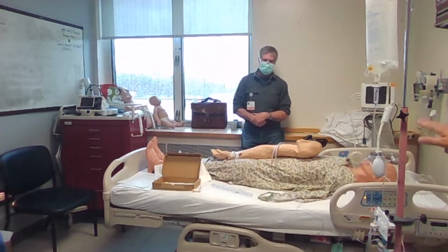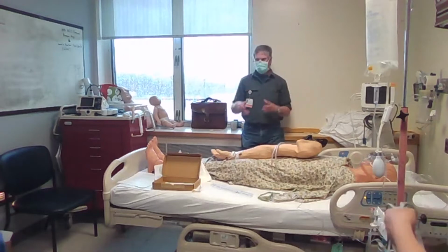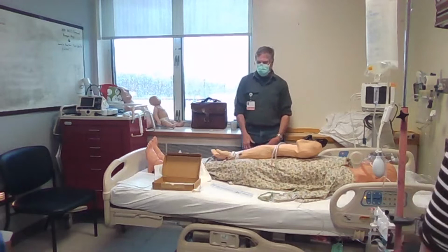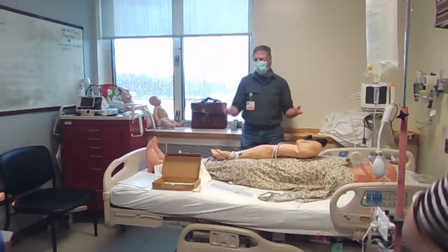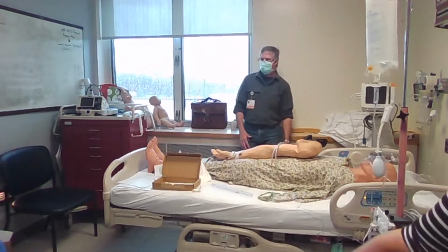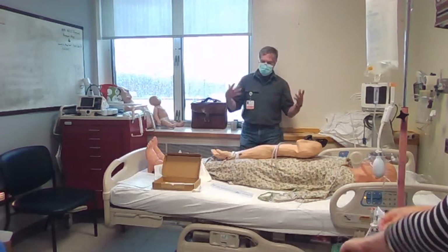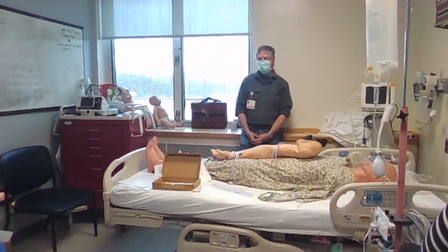But the patient itself is not that sensitive to pressures. No, but the membrane is. And a lot of people will say, oh, you've got to do this, you've got to do this. But realistically, if you're in a situation where you need to put in an A-line, it's not going to be the operating room before surgery where you've got all the time you want, you can set everything up and everybody's there waiting. It's going to be the time when you've got other things happening, and you can let that be, that's not a big deal. I can focus on something else, right?